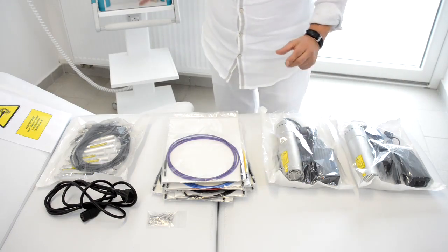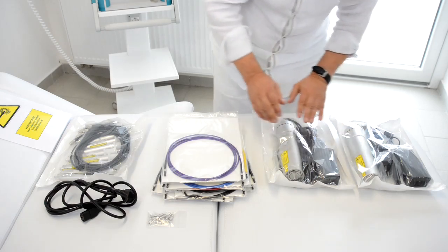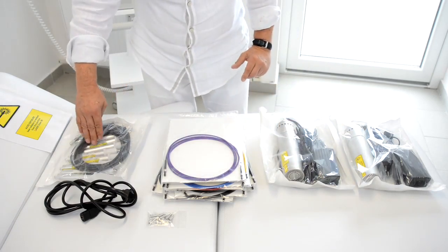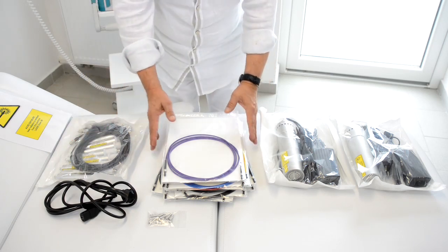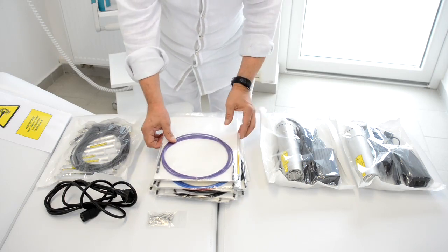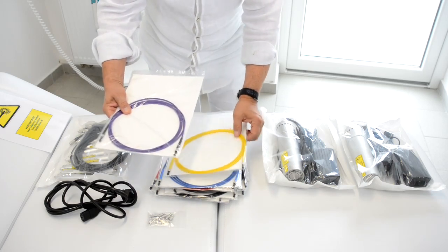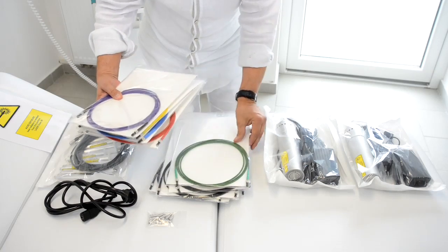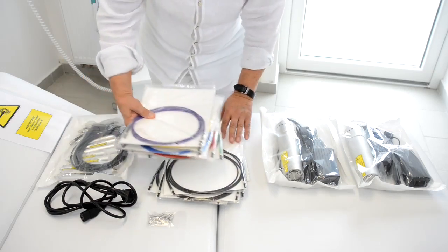In this device now we will connect ultraviolet diode, yellow laser, red, green, blue lasers, and also 6 infrared lasers. For better recognition we made the optical fibers in different colors. You see, this is violet for ultraviolet, yellow, blue, red, green, and the black ones for infrared.